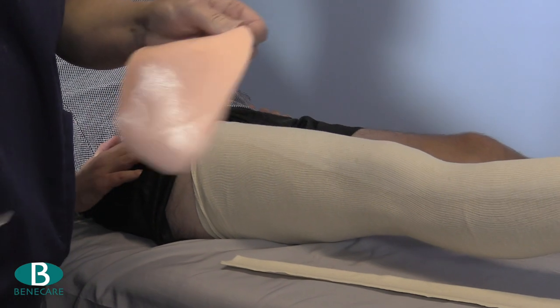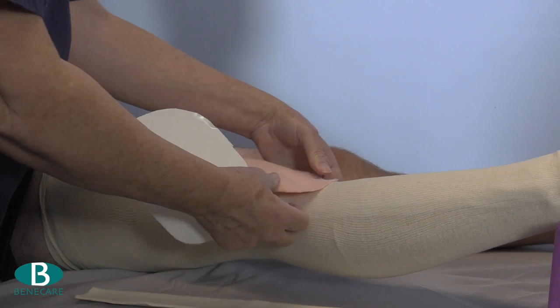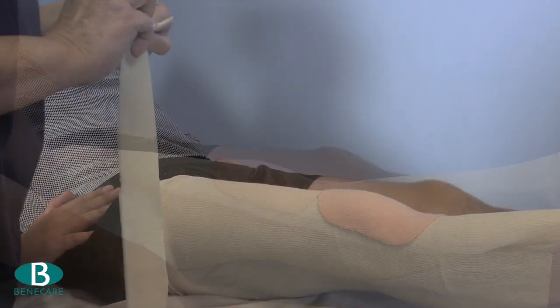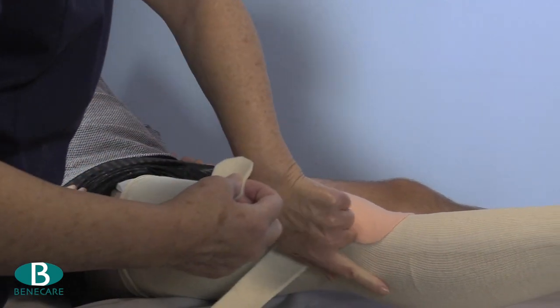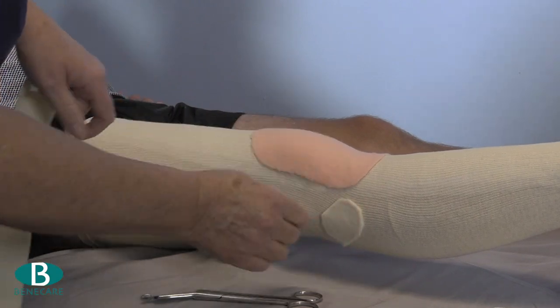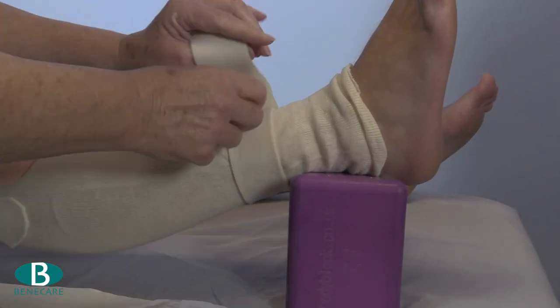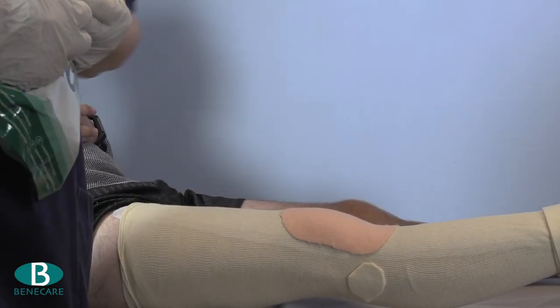The additional padding required includes a large adhesive pad over the knee, a small pad on the fibular head — for which you may prefer to use a negative padding approach — a double turn around the ankle, and depending on the patient, an extra strip could be required around the proximal aspect of the cast.